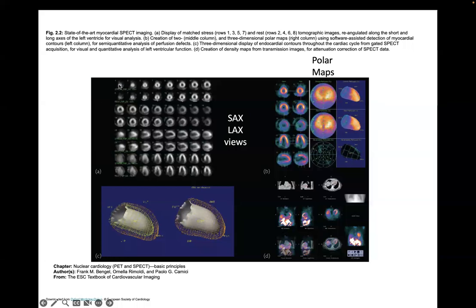And what we're doing is we're going from the apex of the heart, which is right down at the bottom here, right at the tip of the heart. We move our way up towards the valve plane on each one of these views. And then this would be sort of around the middle of the heart. You can see sort of a right ventricle shape here, all the way up to where the valve plane is. Right? So that scans through the entire heart. The point of these images is to map where is abnormal flow, if it exists. Where in the heart does that abnormal flow exist?